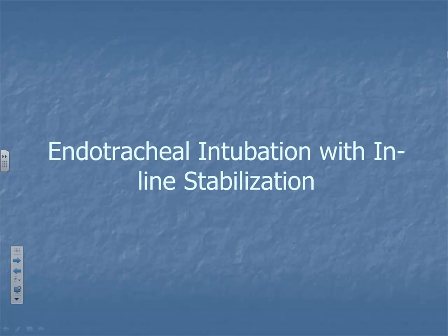Okay. Moving right along. Sometimes you might have to intubate a patient with a potential spinal injury, so you're holding C-spine with them. You can go ahead and put a C-collar on, and I recommend that before you try to intubate them. That's going to help you and your partner, whoever's helping you, remember to hold inline stabilization. If you're not able to intubate, or you're not able to get an airway, you're not able to bag a patient who has a spinal injury because you've got the C-collar on, in that case, which is more important, spinal immobilization or a patent airway? It's going to be the airway every time.